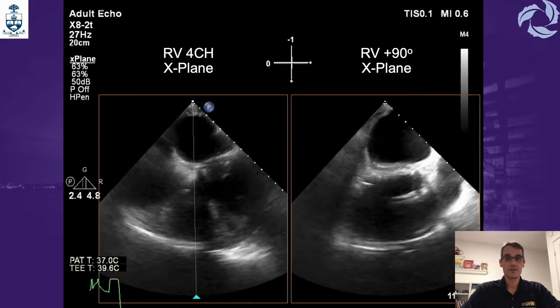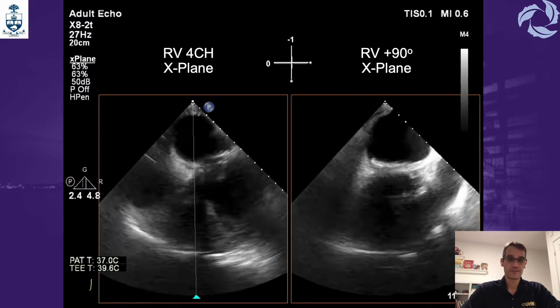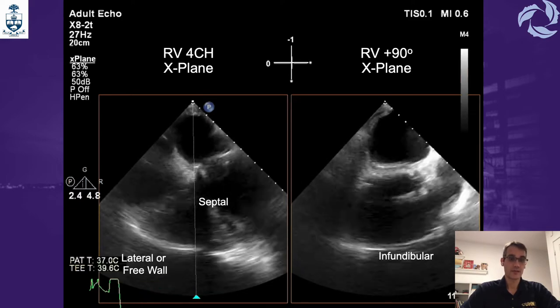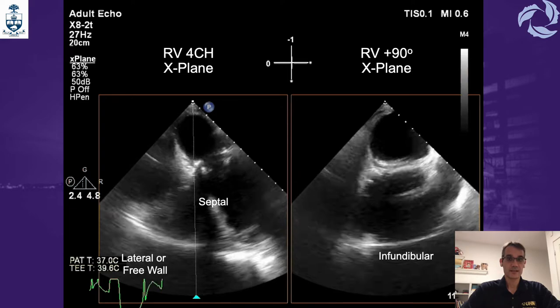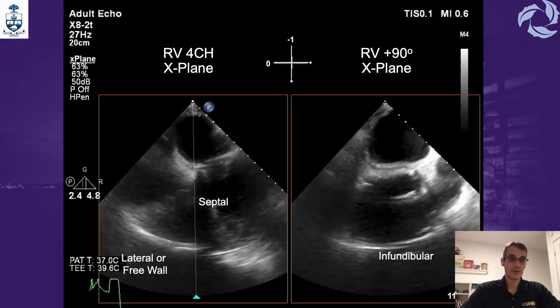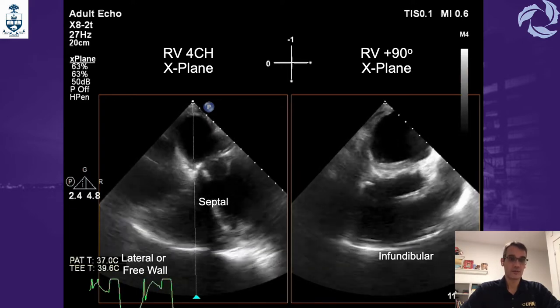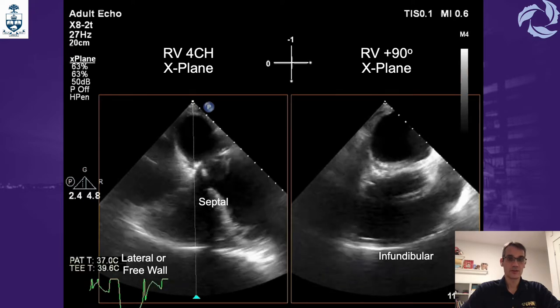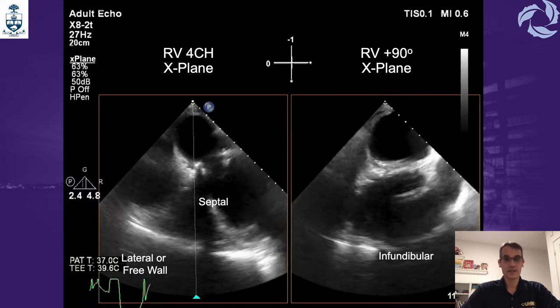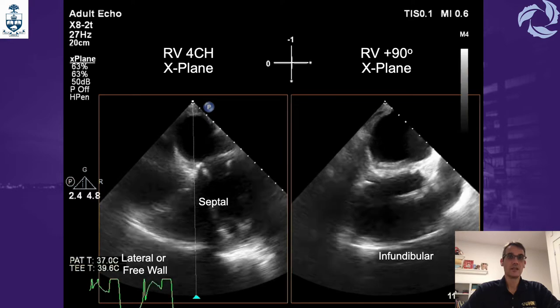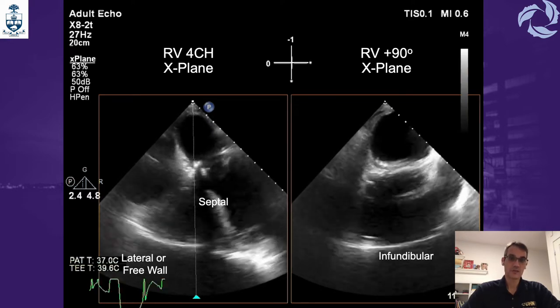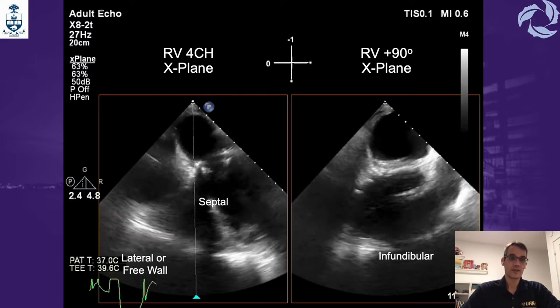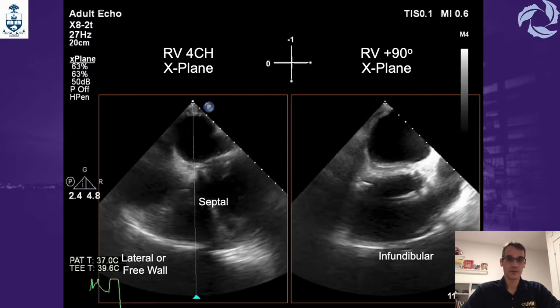The same thing can be done with the right ventricle. Departing from the modified four-chamber view, as seen on the left side of the screen, we can see the septum and lateral or free wall of the right ventricle. When we place the X-Plane in the middle of the right ventricle, we generate a picture on the right side which is 90 degrees separated from it, and you can simultaneously assess the infundibular wall. In a single view you can assess a lot of the RV function.